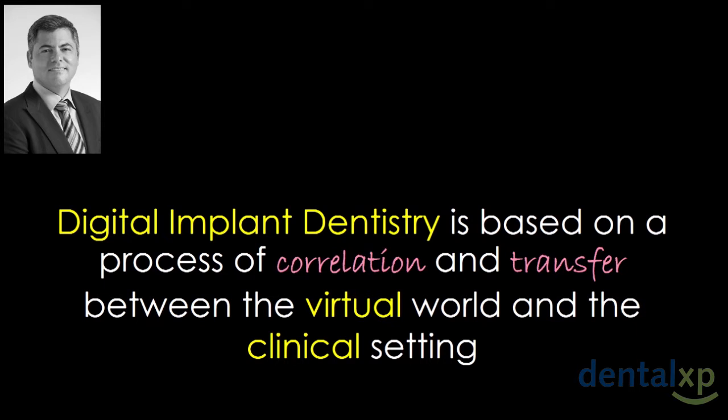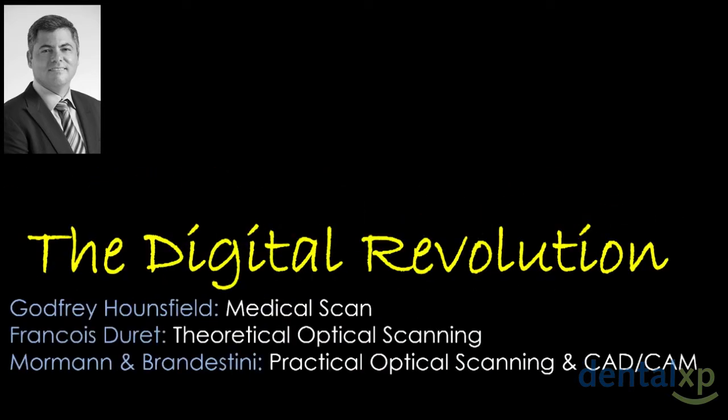And I keep on showing this slide. Digital implant dentistry is based on a process of correlation and transfer between the virtual world, which is your computer, and your clinical setting. If you have this super clear and you're able to mentally travel from one world to the other, 90% of the problem is already resolved. And you're going to see this statement all over the lecture.